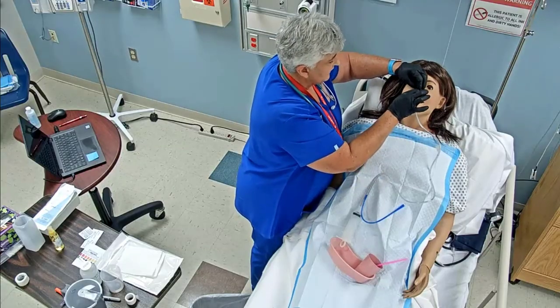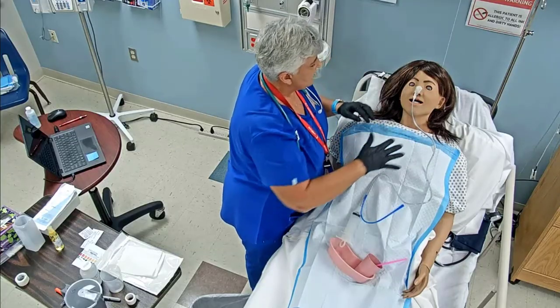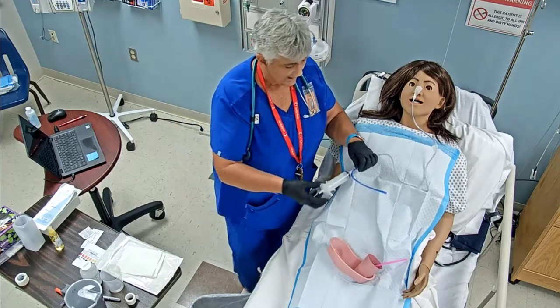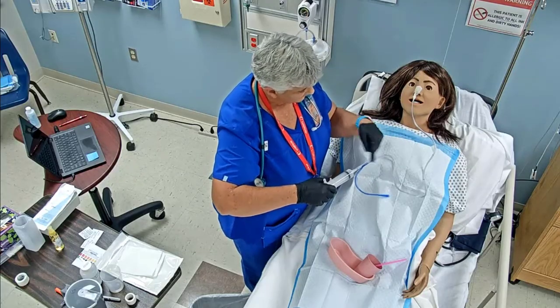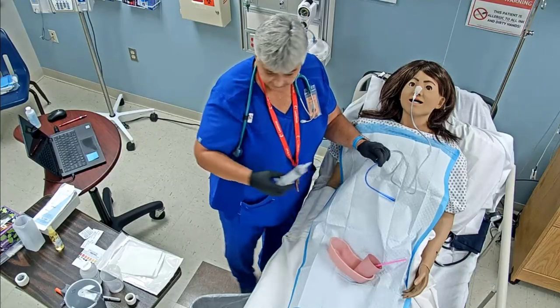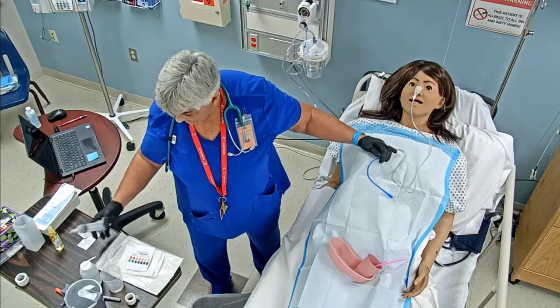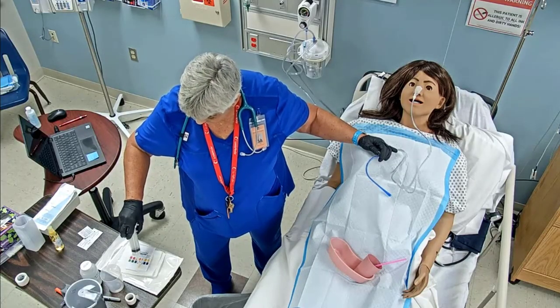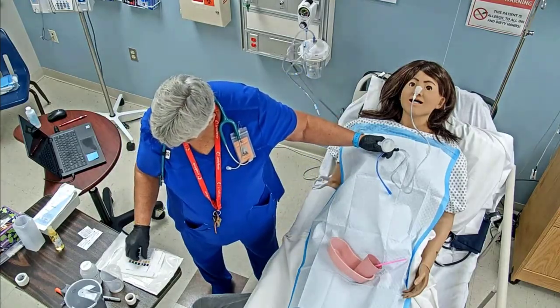Our marker is up here now, so we've made a note of where that marker is. Once we have done that, now we're going to check our placement. I'm going to remove some of the content and look at the drainage, what is actually coming out. I'm going to put that on there, leave it for now, and I'm going to measure it.